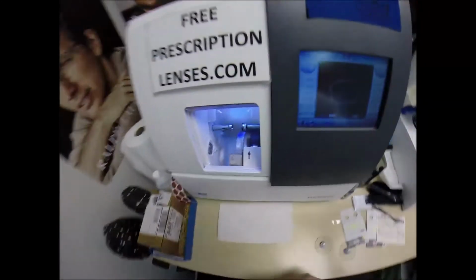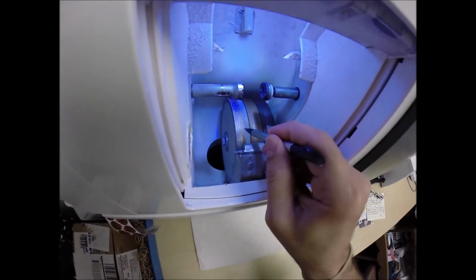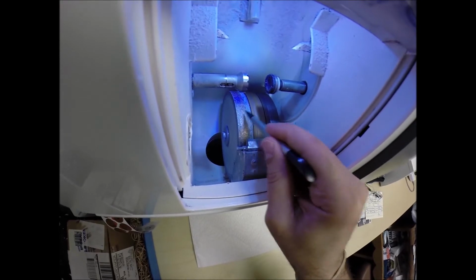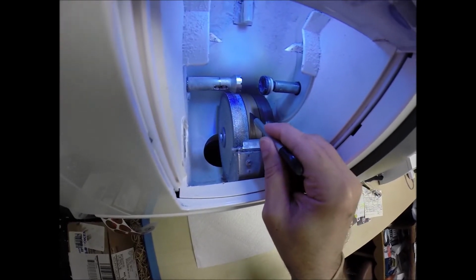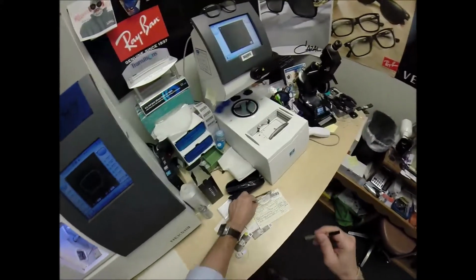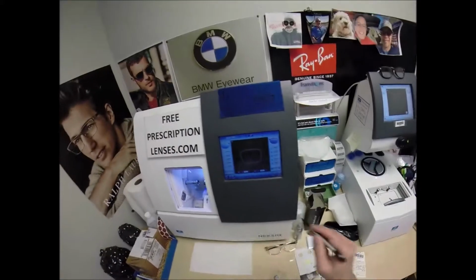But the actual cutting wheel, I catch myself when I make mistakes though. The actual cutting wheel is this diamond crusted wheel that's going to grind away your lens material until it's the final size. This wheel in the center has the channel, that little valley in there. That's what's going to put the V-shaped bevel onto the lens so it stays inside the bevel of the frame.